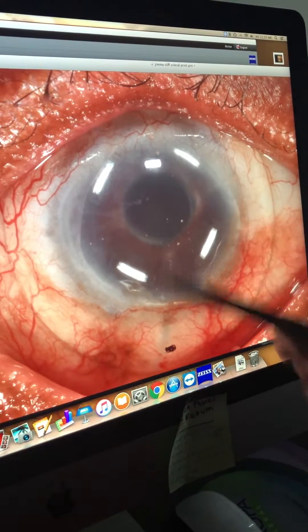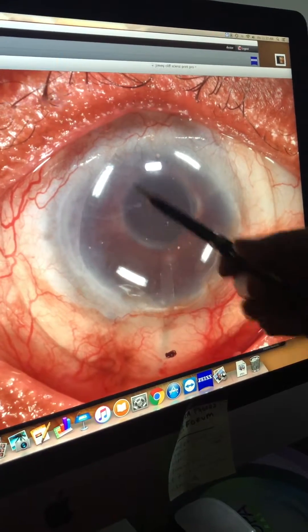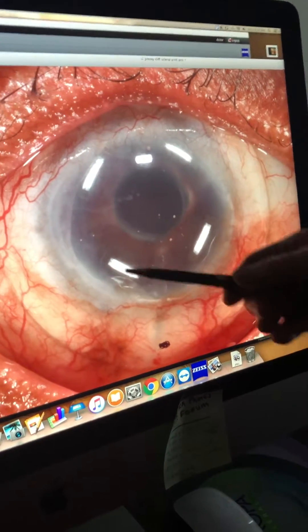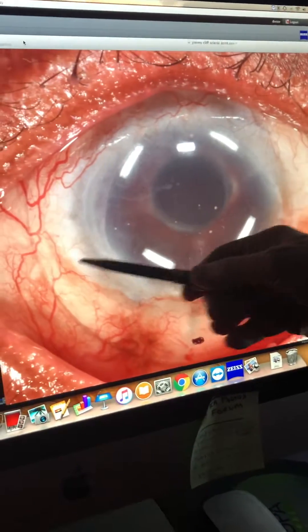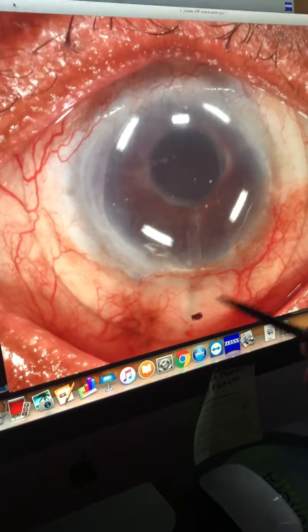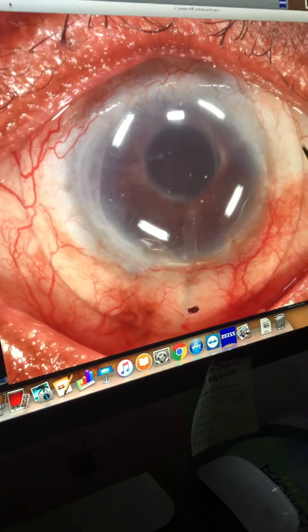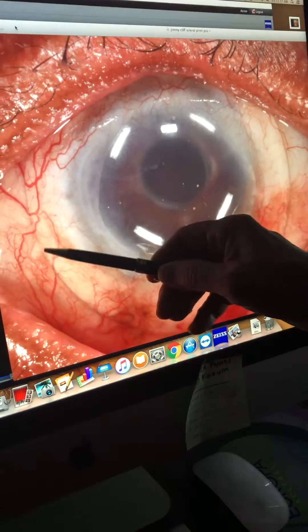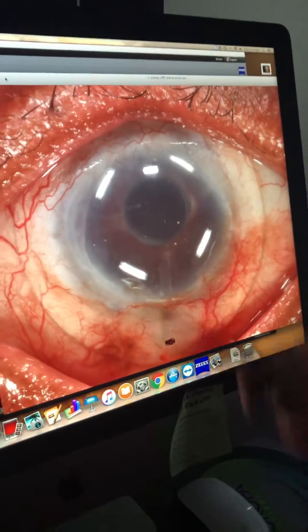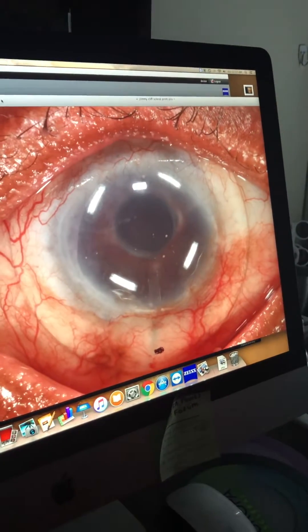So we'd say this patient has 20/30 plus visual acuity. The lens is very comfortable for the patient, and you can see the edge of the scleral lens here. The patient's doing very well. Thanks for viewing.